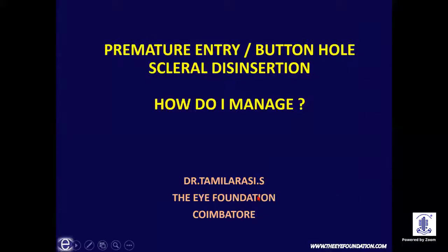Thank you, ma'am. Thank you for your kind words. Very good evening, all. Today, I'm going to talk about managing tunnel complication. A key aspect of small incision cataract surgery is the structural integrity of the tunnel. It means the tunnel has to be self-sealing. The second important aspect is the magnitude of astigmatism we are going to induce or correct with our incision.